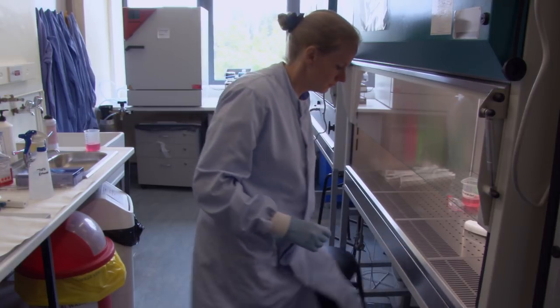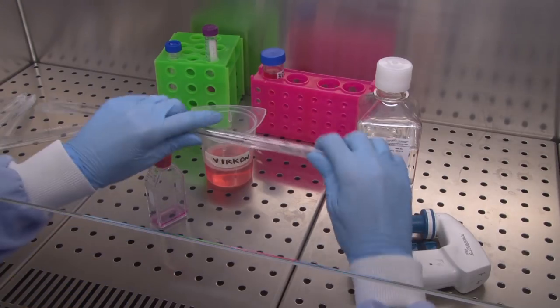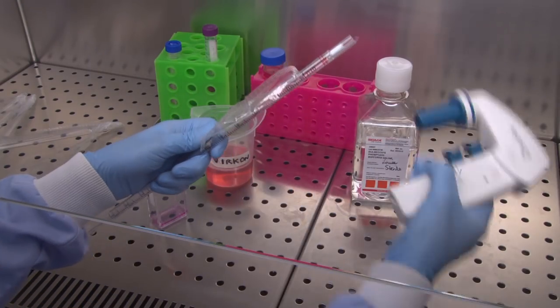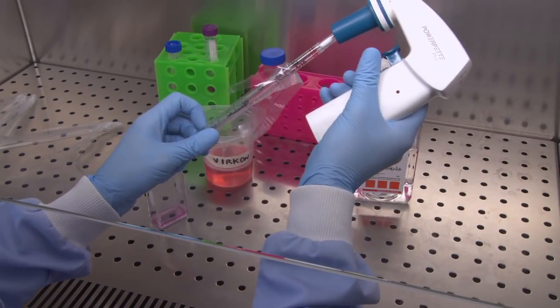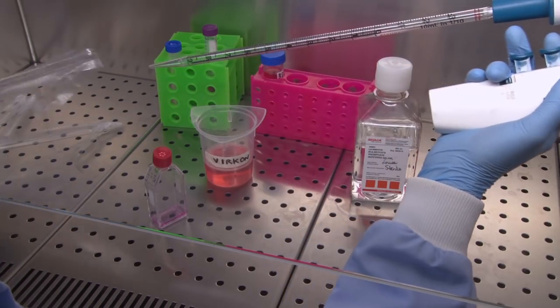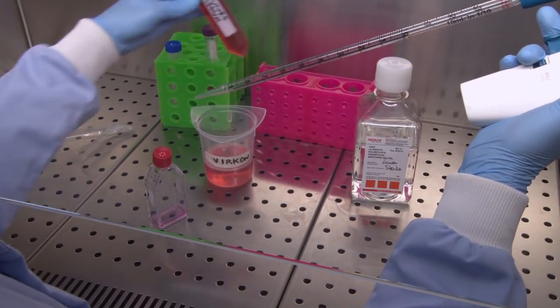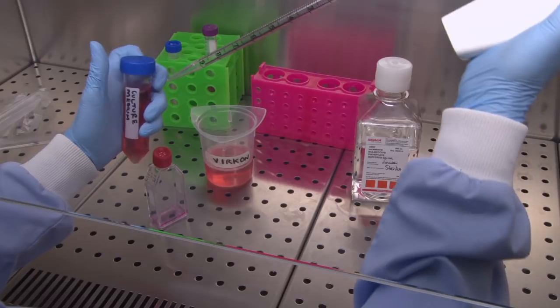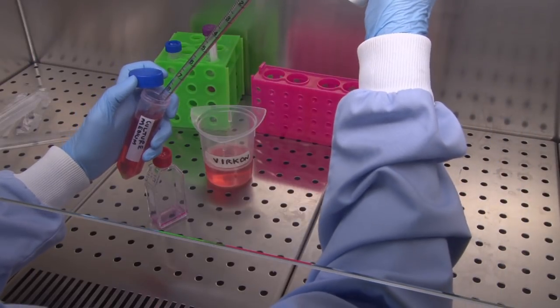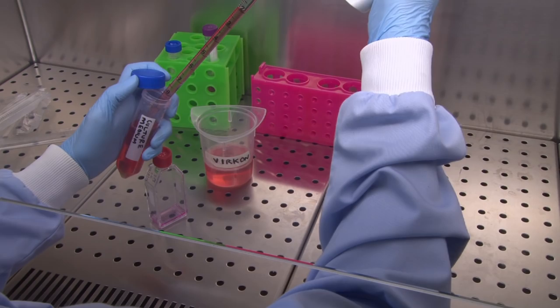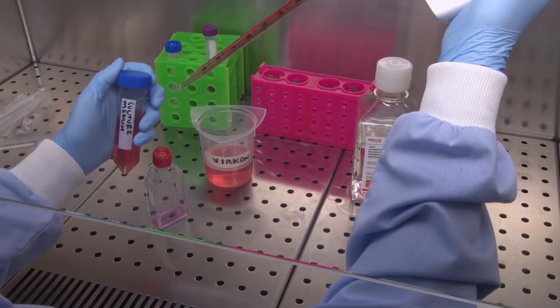To arrest the trypsinization, and prevent damage to the cells, we add fresh culture medium, which provides lots of protein to mop up the trypsin. Take a pipette and open the container using one hand. Fill the pipette and pour the fresh medium down the back wall of the flask, which washes the cells to the bottom.